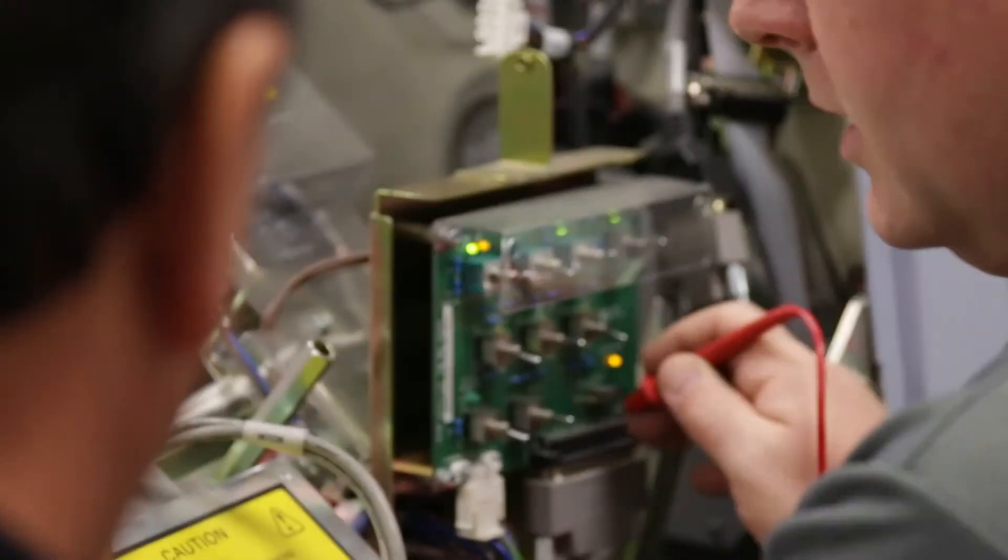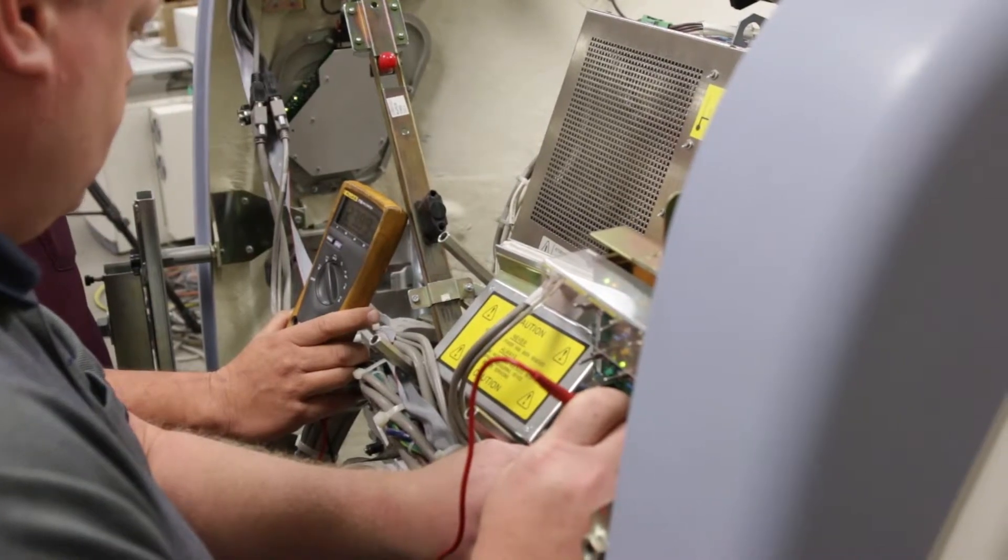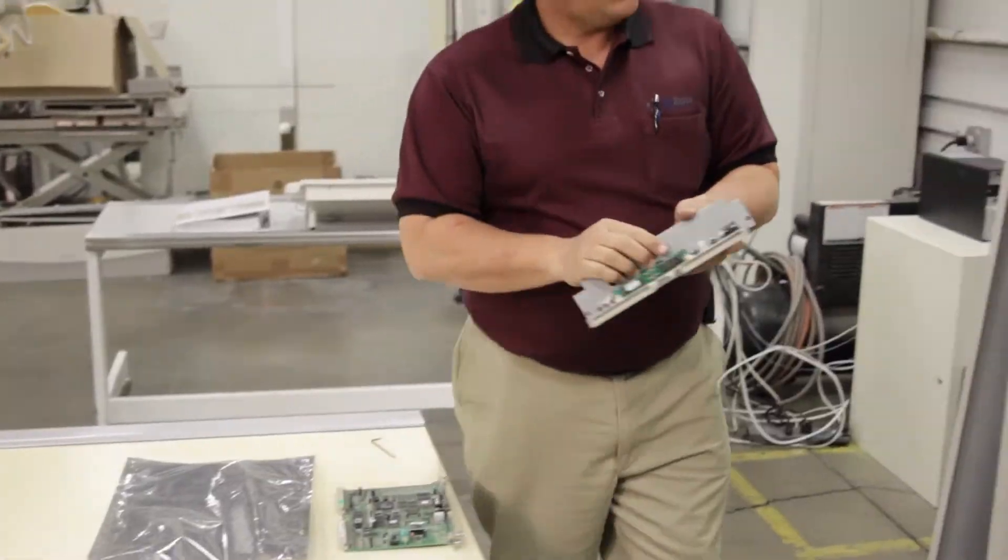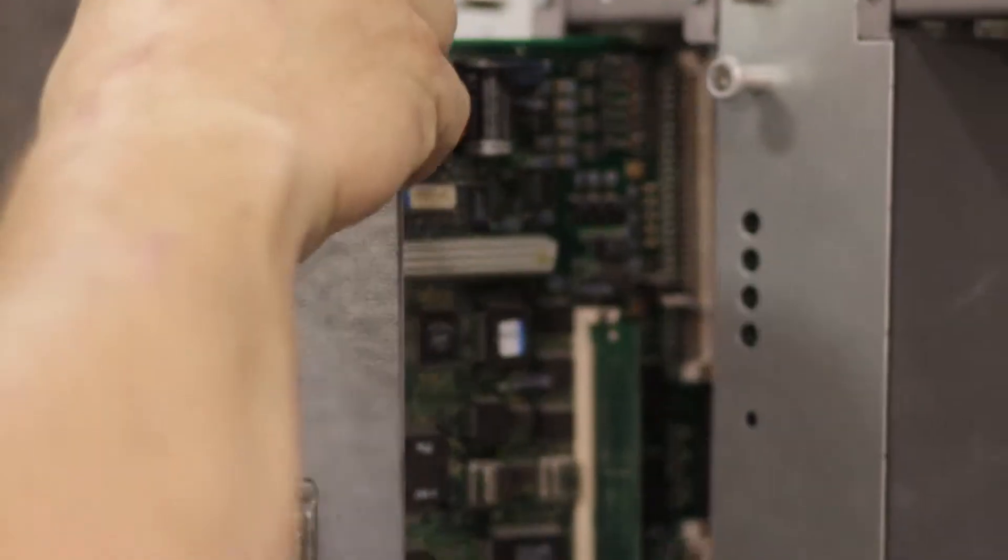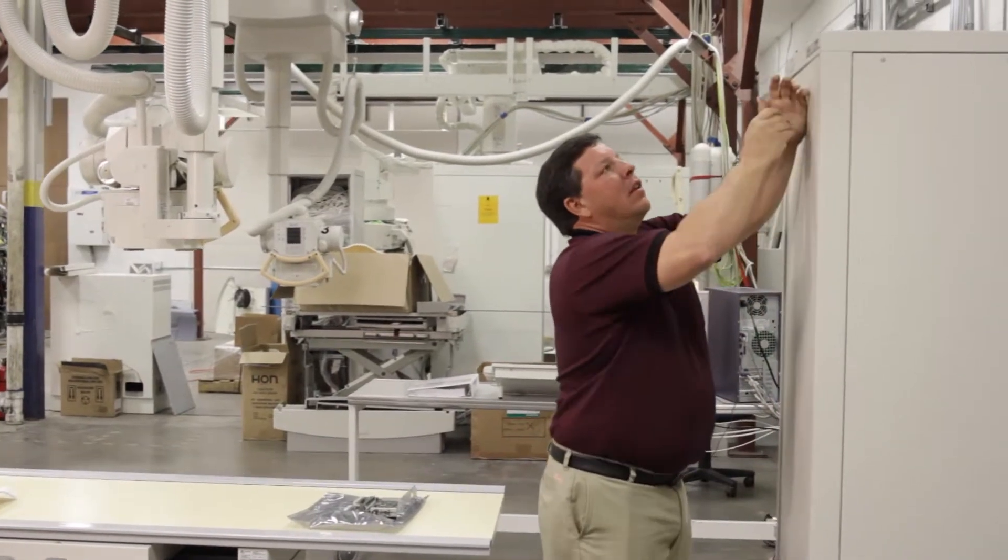While the systems are disassembled for paint, we check systems for functionality. Systems checks are run and components that don't meet or exceed factory specifications are replaced. Once the systems meet specifications, the refurbished covers are reinstalled and the system is again tested for functionality.